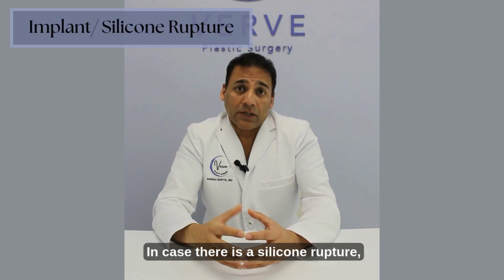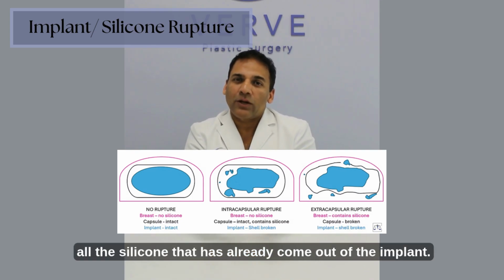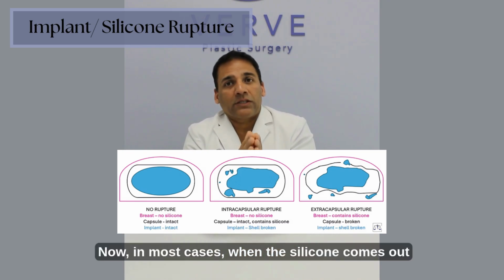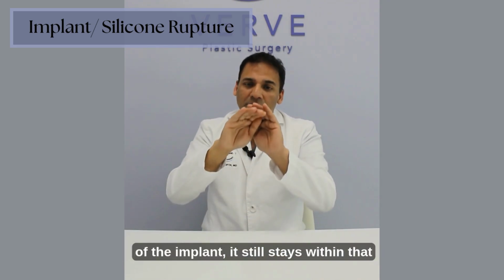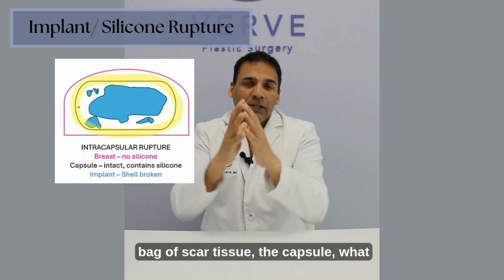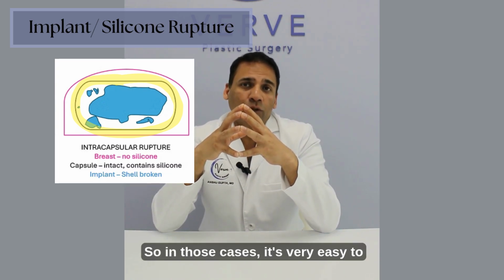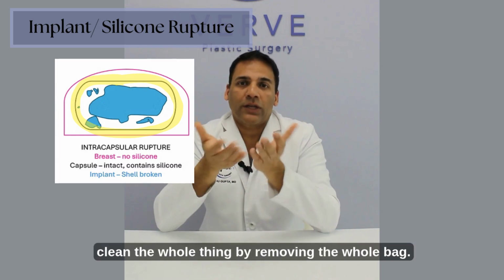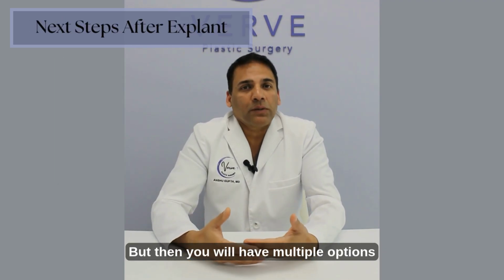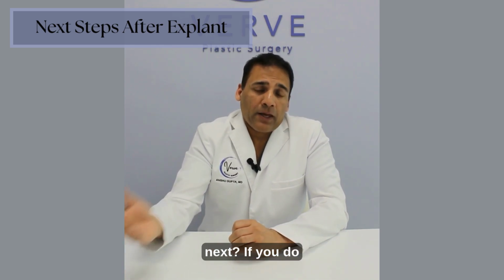In case there is a silicone rupture, then we will also need to clean up all the silicone that has already come out of the implant. Now, in most cases, when the silicone comes out of the implant, it still stays within that bag of scar tissue, the capsule, what we call intracapsular rupture. So in those cases, it's very easy to clean the whole thing by removing the whole bag. But then you will have multiple options as to what you want to do next.